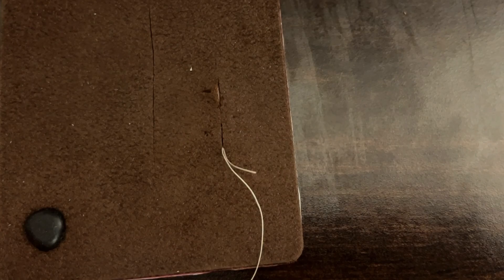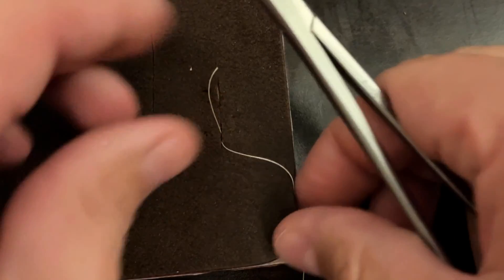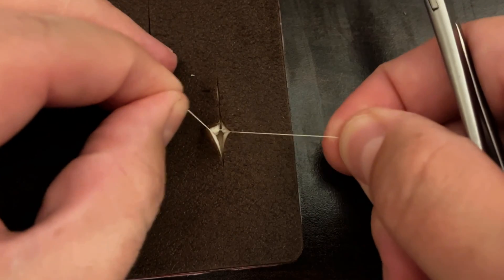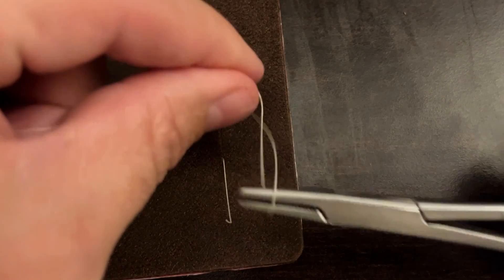Shorten that down a little bit — both tails on the same side of the loop. Pull that a little tighter. Make sure we're not all twisted up before we tie — get it untwisted first — and then go ahead and instrument tie, giving it some decent pressure but not too much.